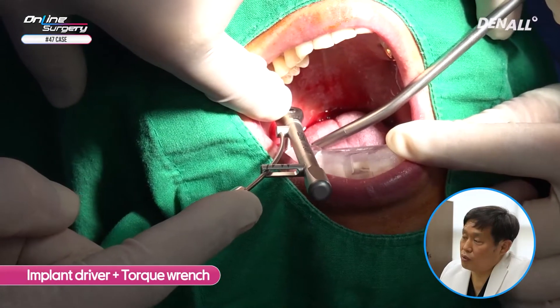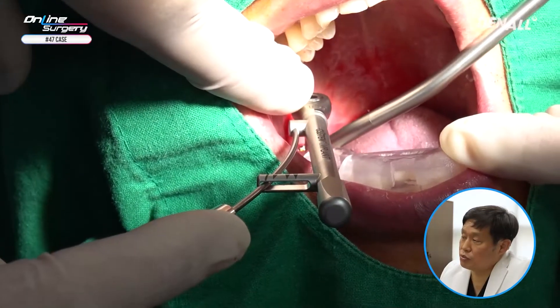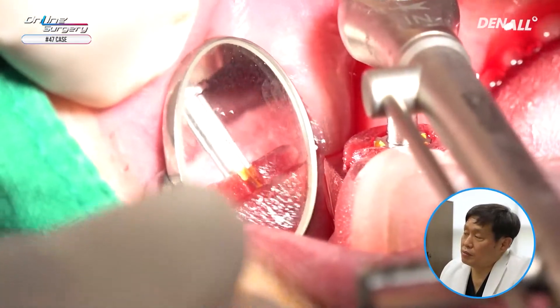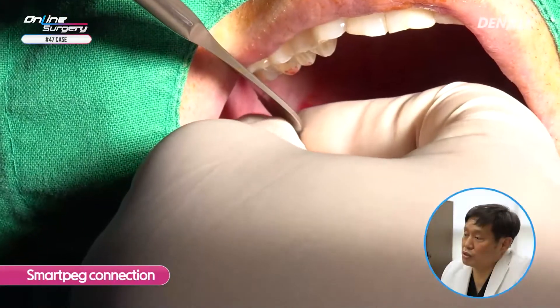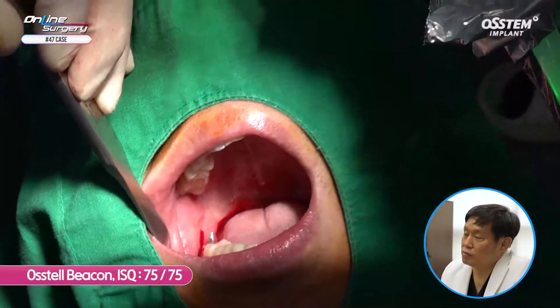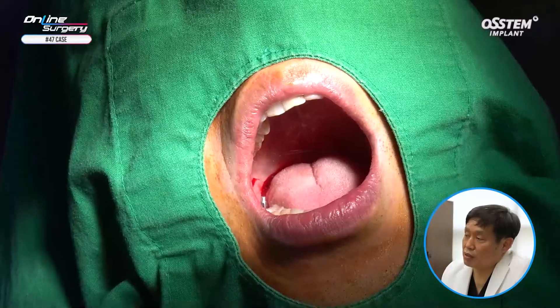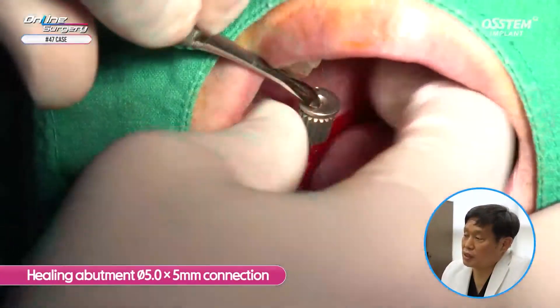After that, the implant driver and torque wrench are used to get the final position. The template is adapted to ensure it goes in properly. Primary torque is about 30 N·cm. You need to check whether the yellow slot is correct before closing the case. To measure ISQ, a smart peg is connected — the ISQ value is approximately 75, which is favorable. A 5.0 by 5 mm healing abutment is connected.